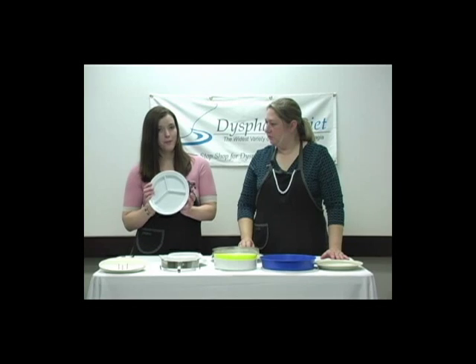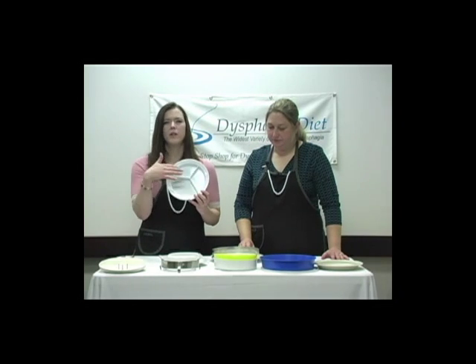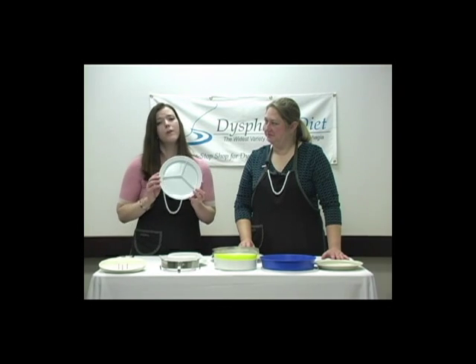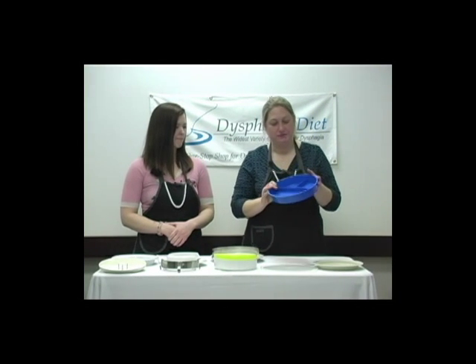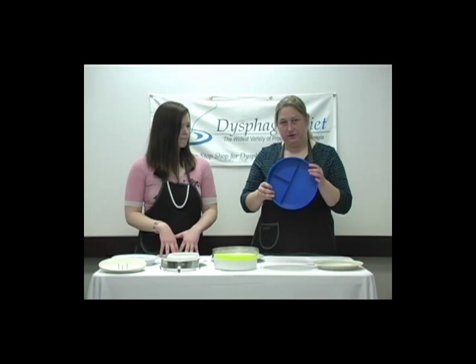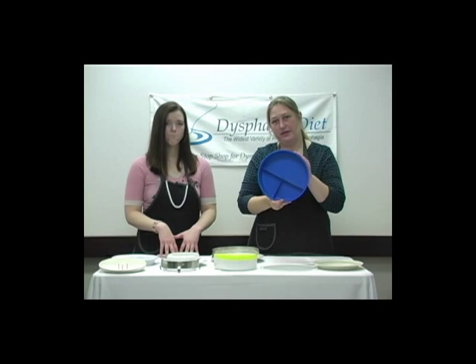And there are also divided plates where the divisions between each section are raised, so that if you've got something juicy on your plate, it's not going to go running around getting all over everything. These types of plates can be especially helpful for picky eaters like me who don't want all their foods touching. Another nice thing about this plate is someone who is visually impaired, you can use it to separate their food, hot and cold, so they can tell those apart. And also you can separate the pieces of their meal out within the plate so they can choose how they'd like to eat their meal.